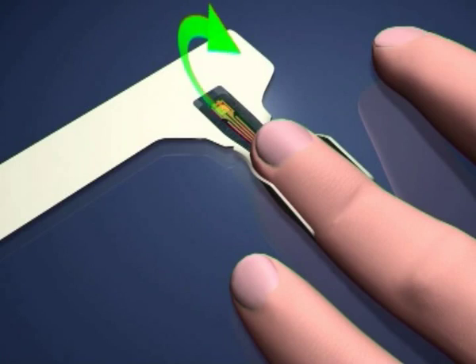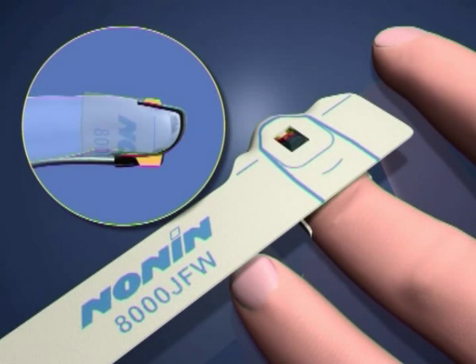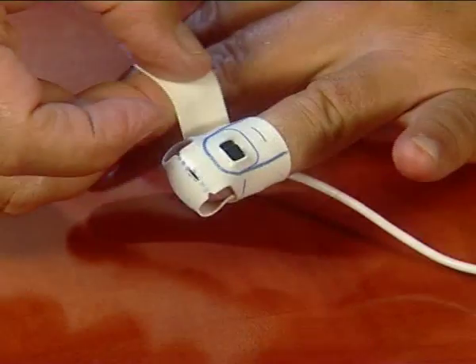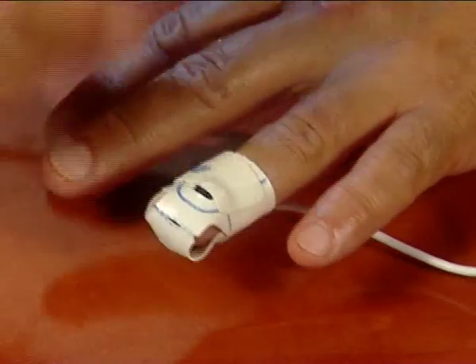Then fold the oximeter over the finger, ensuring that the black protrusions are facing each other. Fold down the side wing and gently wrap the long flap around your finger. Make sure not to wrap the end flap too tightly.